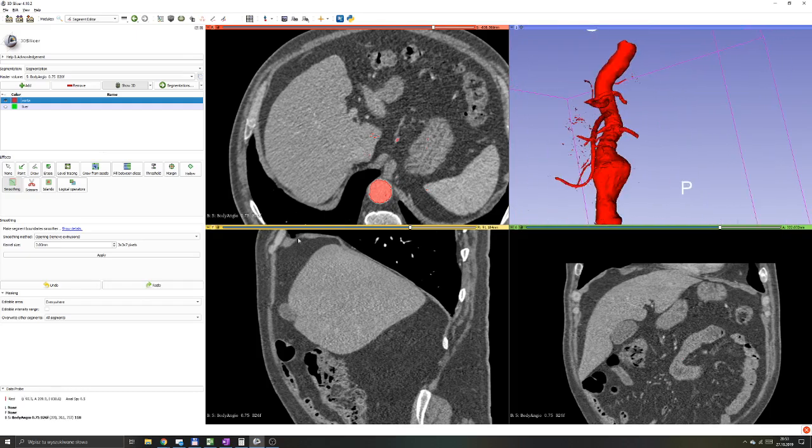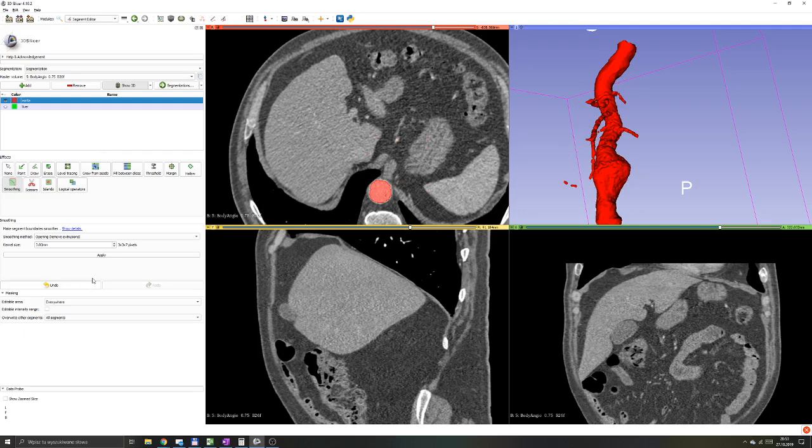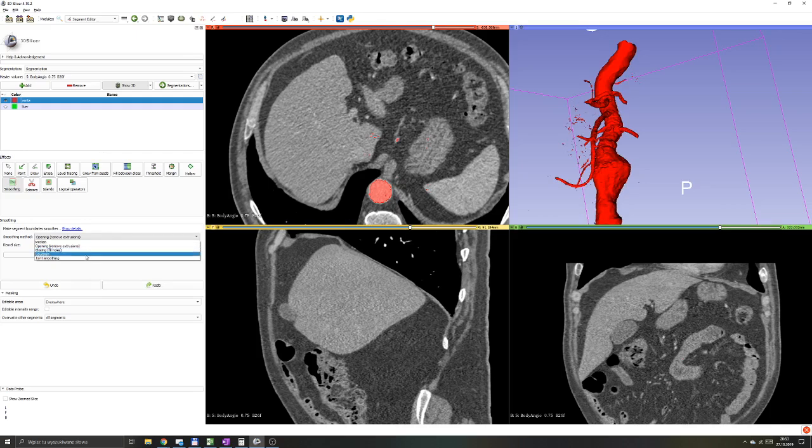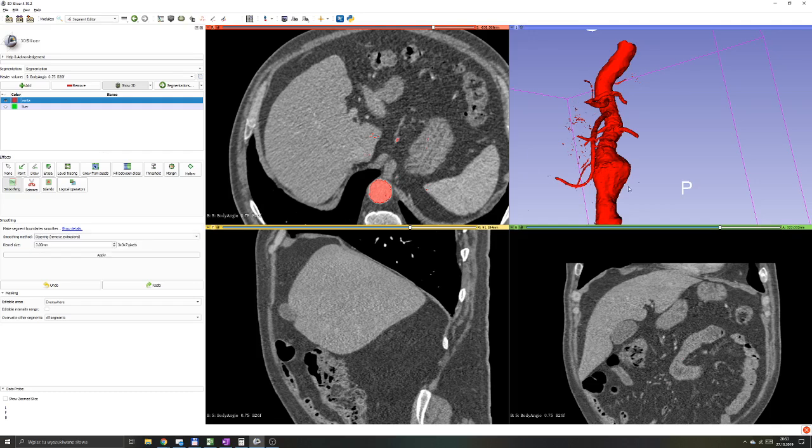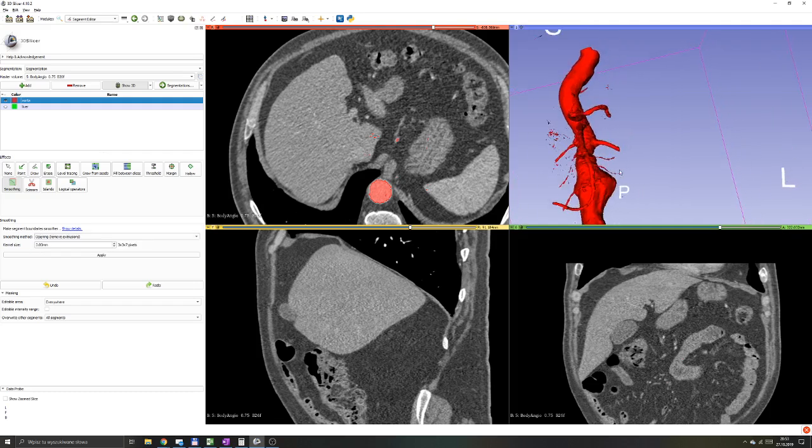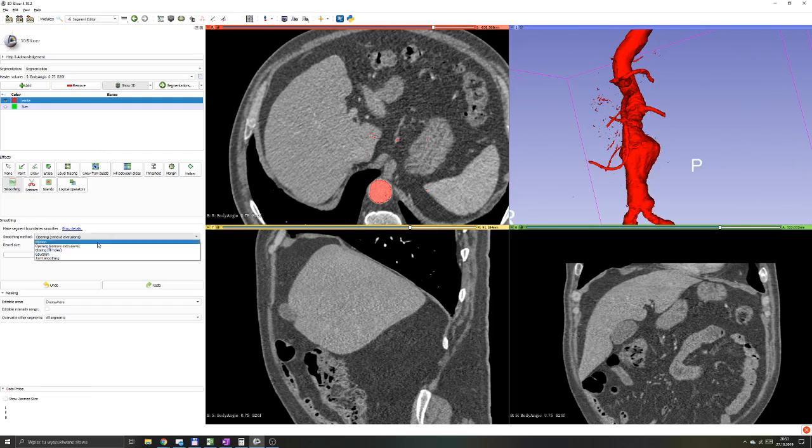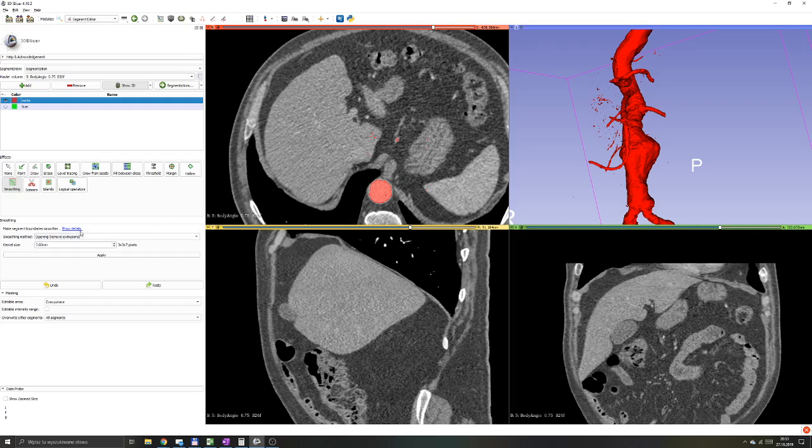Maybe the kernel size was too big, but again, this is mostly trial and error. Definitely, I would not use Gaussian smoothing method for little structures, for little vasculature. I'd go for something more impactful such as median, opening, or closing methods.